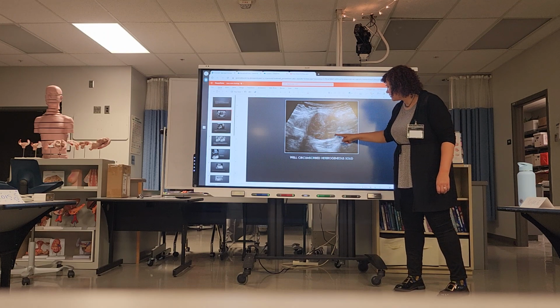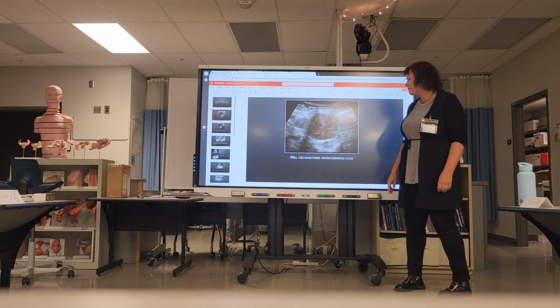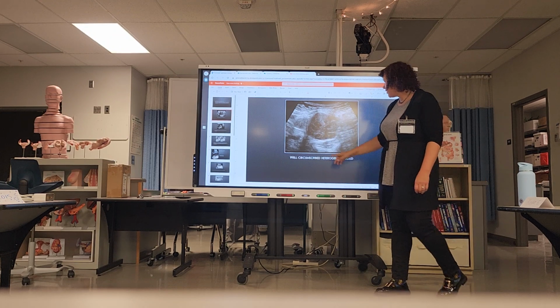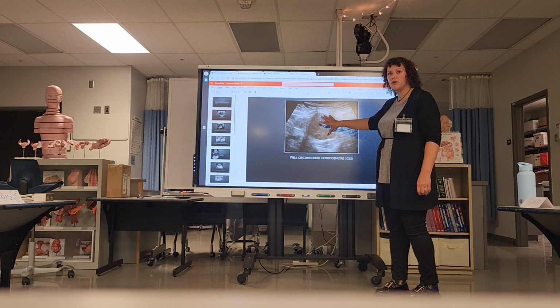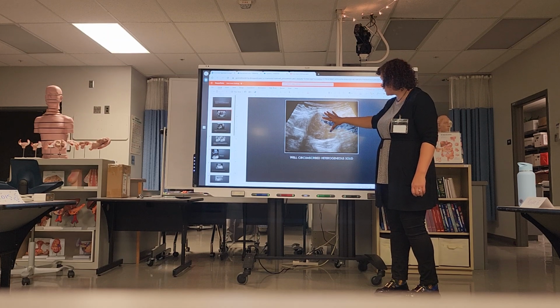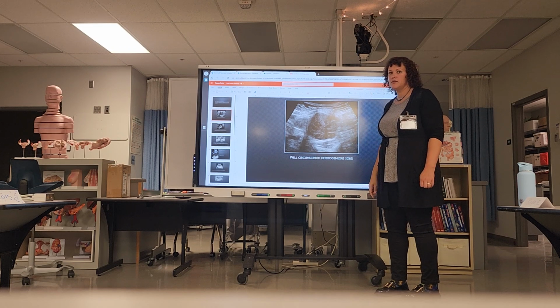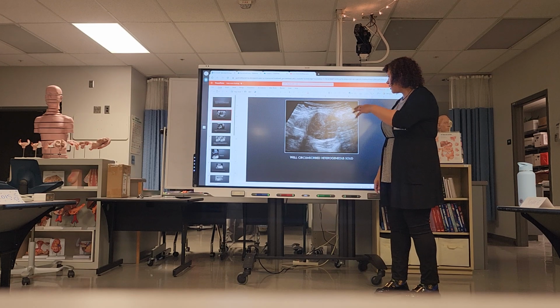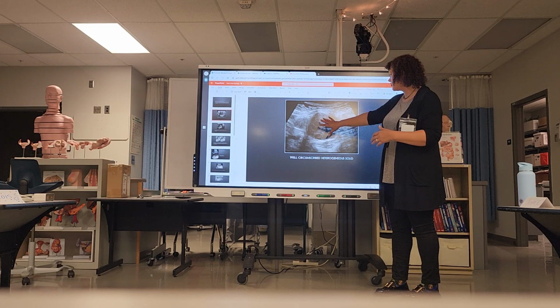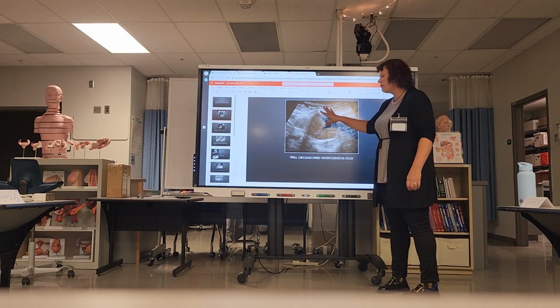Yeah, they're lobulated, but we can make them out pretty well. All right. Is there enhancement underneath? There is a little bit of enhancement, but we have kind of a mix going on here. It is more solid than it is cystic. So we've moved past a complex structure. We're just at solid. It does have some cystic areas, but it's mostly solid.